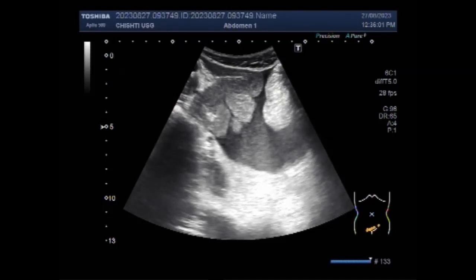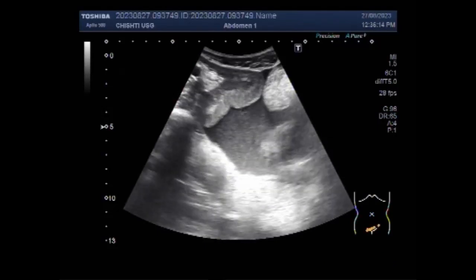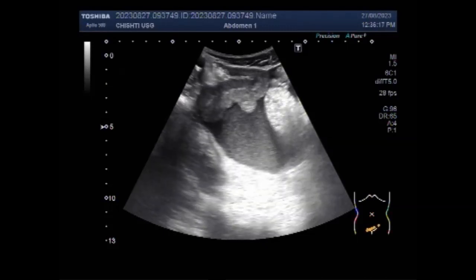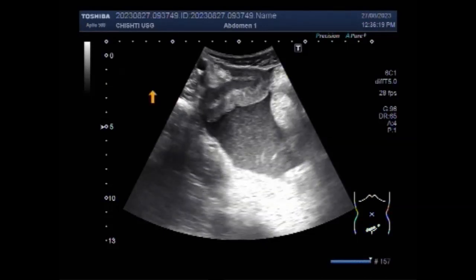Now you can see the lower abdominal cavity, and again a large amount of free fluid which is thick and turbid, seen in the lower abdominal cavity in the area just above the urinary bladder. Gut loops are seen floating in this fluid, but no intestinal motility is seen.